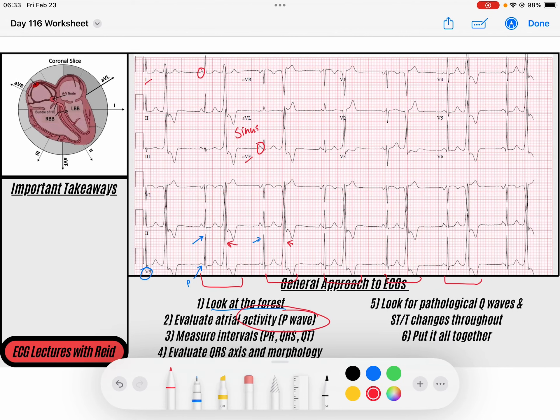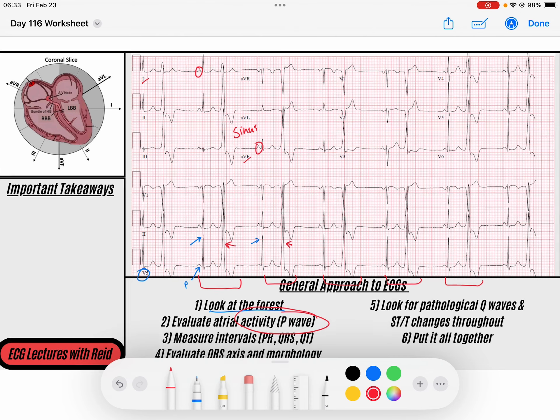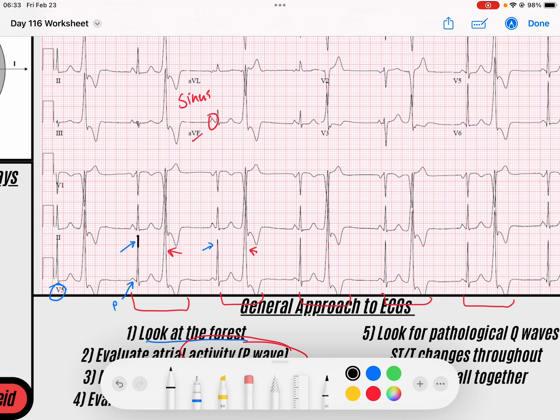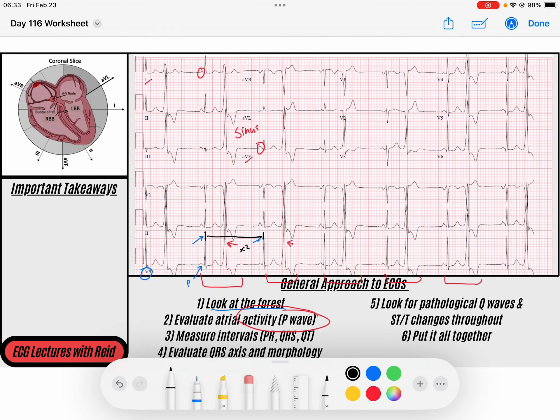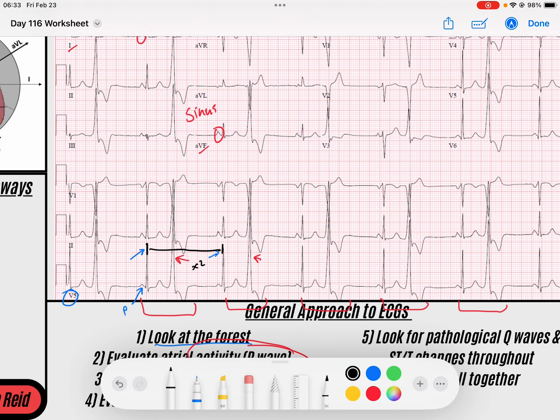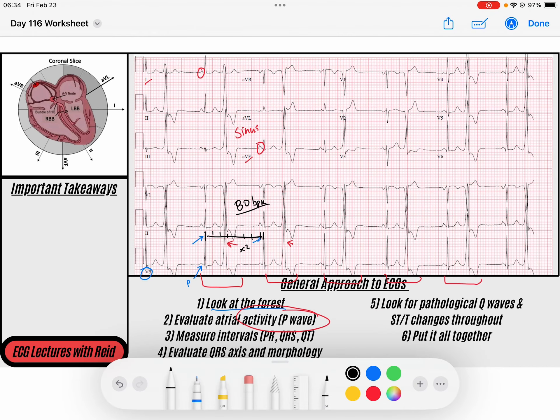P waves are upright in lead one and upright in AVF, which tells me these are sinus P waves. To get the average rate, you can take this QRS to this QRS and multiply by two, or count the entire strip and multiply by six since the ECG is a 10-second rhythm. Doing that calculation gives us roughly 80 beats per minute.